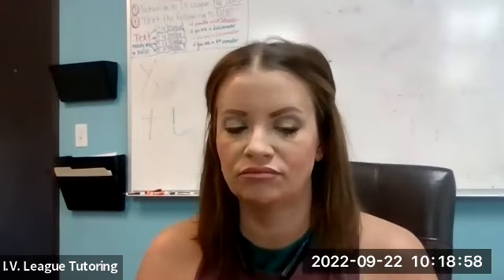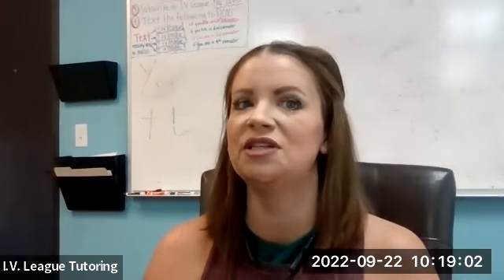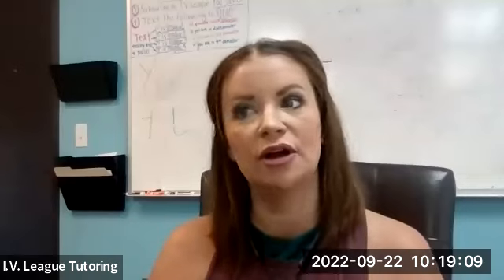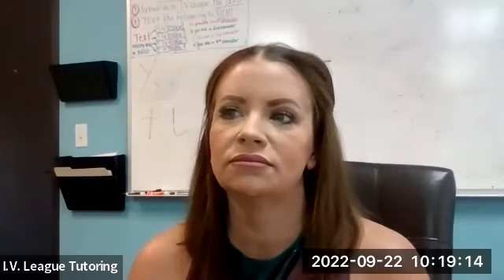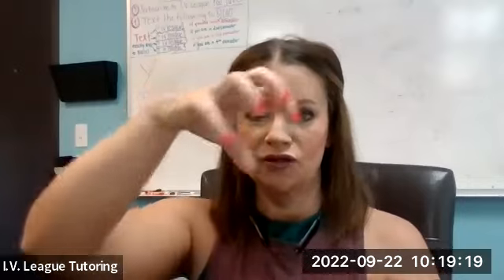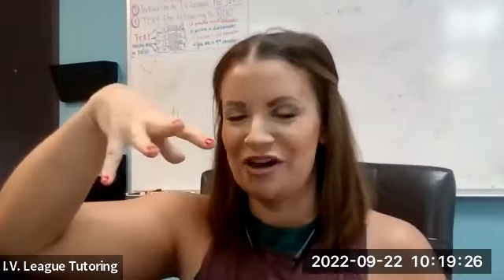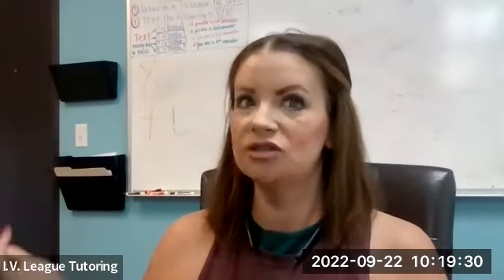Is it like the atrium filling? Atrial depolarization, which means the atria is doing something. Oh, so it's contracting. Right, that is atrial contraction. It's smaller because the atria don't have to pump as hard as the ventricles. How come? Is it slower? Less resistance. Right, it's at the top. So the atria are up here, literally all they have to do is open the valves. Like you said, open their legs. That's it. They just had a baby. So it just opens. That's it. And by gravity, it makes their job very easy.